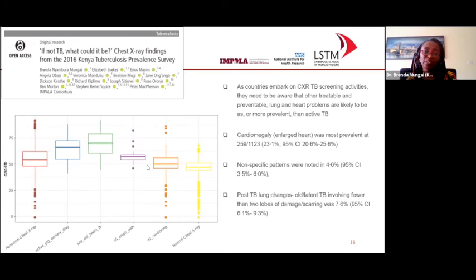But the CAD score was then at 50. So that means that depending on what our threshold scores are, you're likely to then miss these other abnormalities, because CAD for TB, for example, is mostly to help you look at possible TB and probably not the other abnormalities.